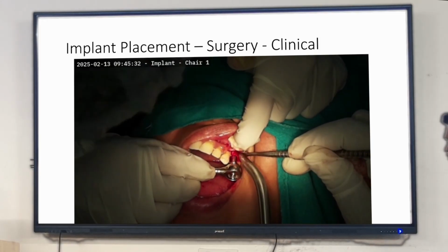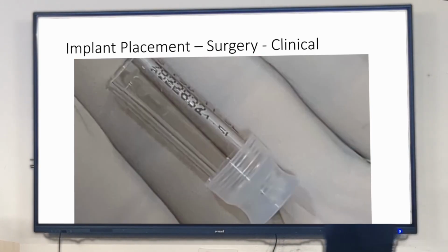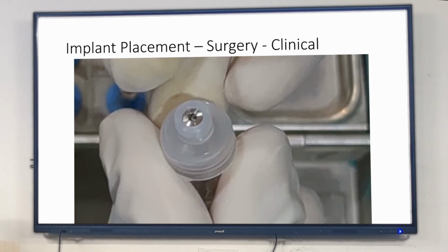Like the one I showed earlier. So you can see the implant has been placed. Next. Again, next. Like the previous demo, you can see the cover screw is placed in the same container.